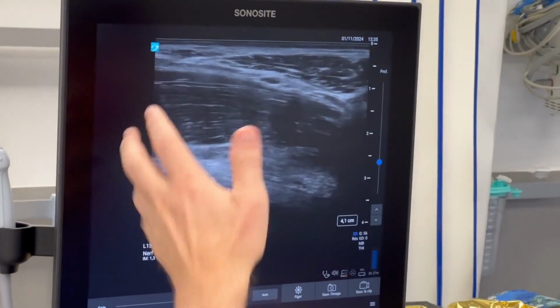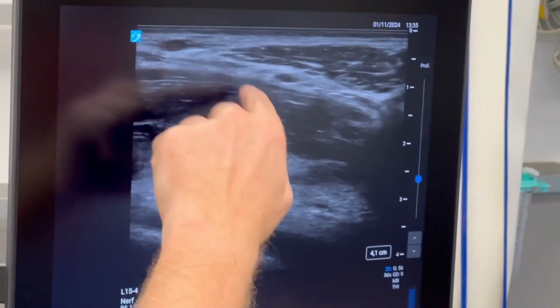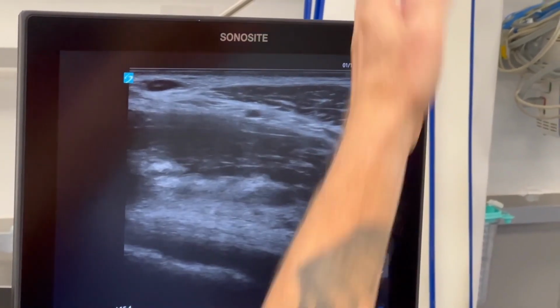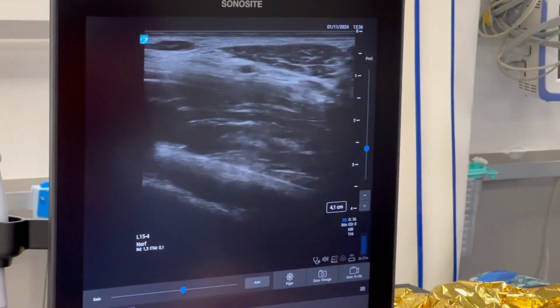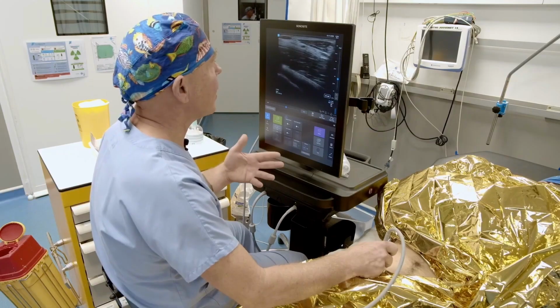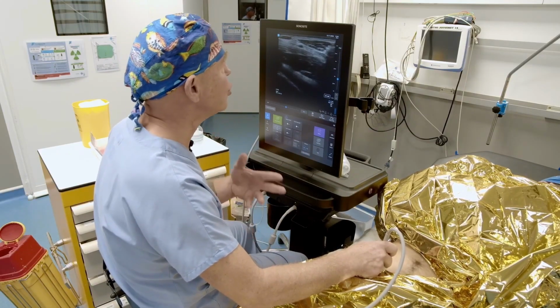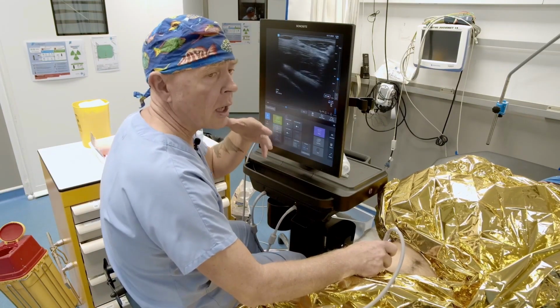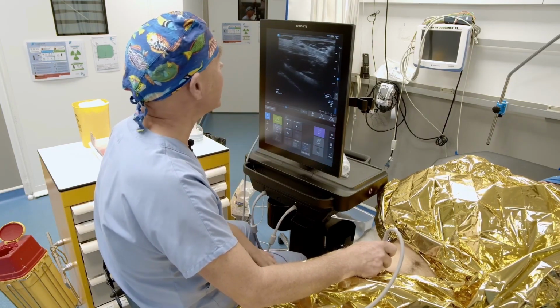And then we have the large iliac muscle coming in, so that's really the typical description. And then the anterior superior iliac spine. So you come in from here, and I recommend injecting a little bit below the fascia in order to make the circumflex artery rise, and you'll have the product spreading up to the femoral nerves. Let me remind you that the suprainguinal approach to the iliofascial block is an exceptional block for all lower limb surgeries, especially knee surgery and femoral neck surgery. And it covers the 3 nerves, so it's the famous 3-in-1 Winnie, but adapted for ultrasound guidance.